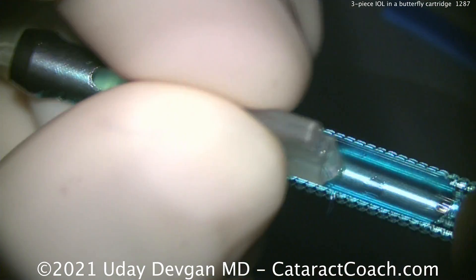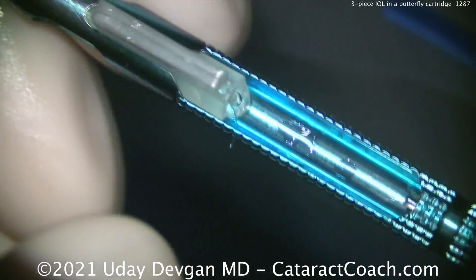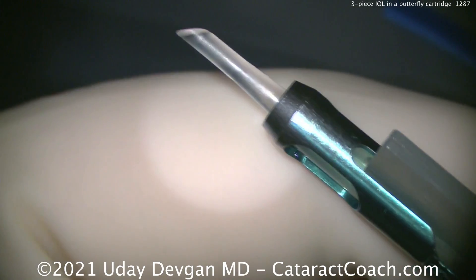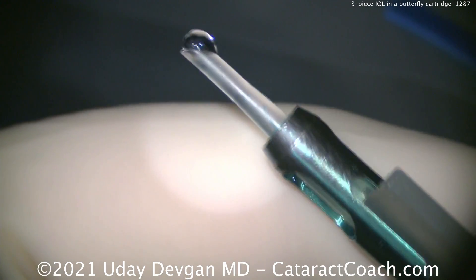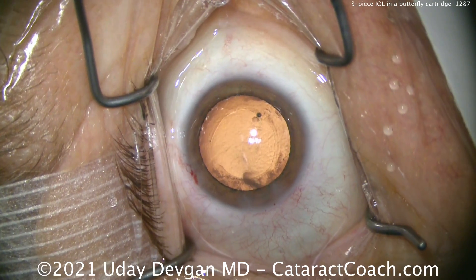We place this now into the injector. This is the proprietary injector system for the formerly AMO or Abbott, now Johnson and Johnson series of lenses — this is the AR40 lens. Now we can start to advance it. Notice how the trailing haptic is outside so it does not get bent or damaged. Push down the plunger and you can see the leading haptic.